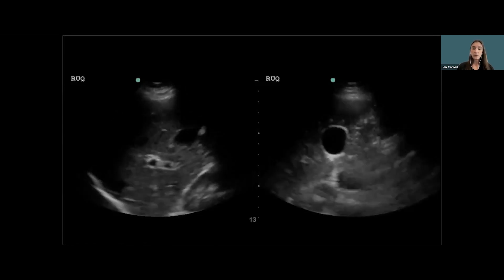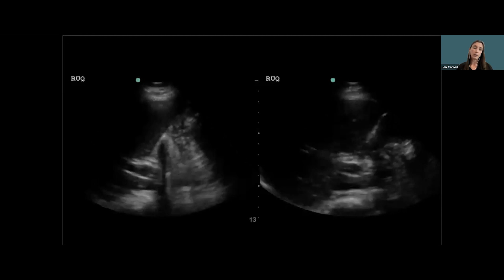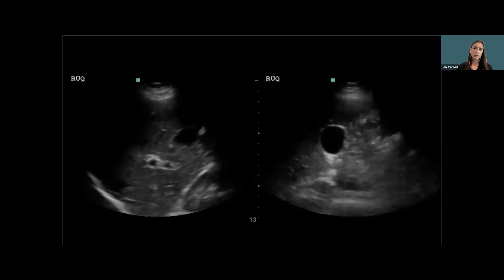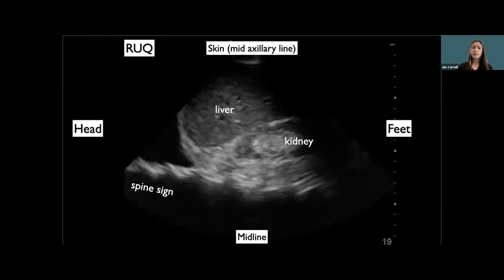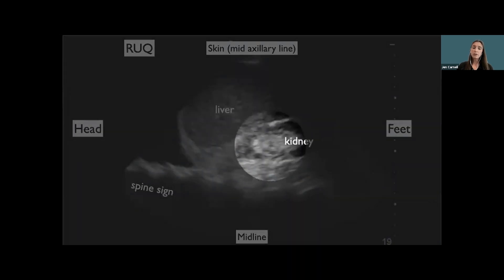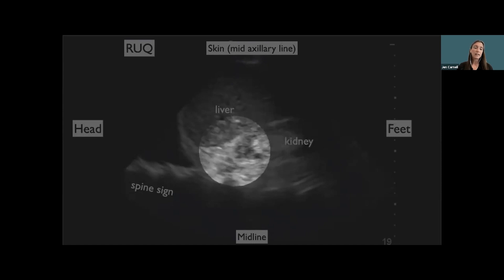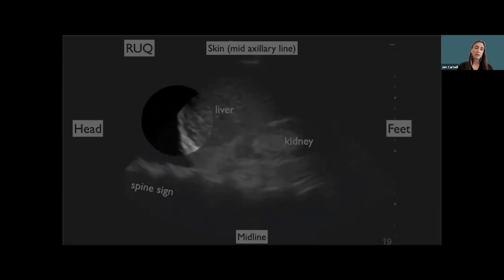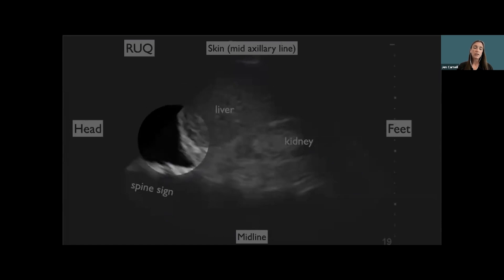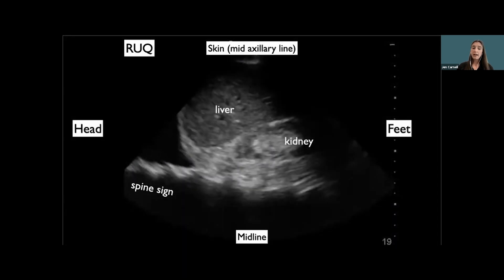The gallbladder can be tricky, so I scan a little more laterally to make sure I'm getting great views. I find our right upper quadrant FAST view and take a quick look at the kidney, making sure there's no black center that would indicate hydronephrosis or a stone. That all looks great. Then I look at the diaphragm — this bright white structure — and just above it is a triangle of black. Black on ultrasound is fluid, so this gentleman has a little bit of pleural fluid.